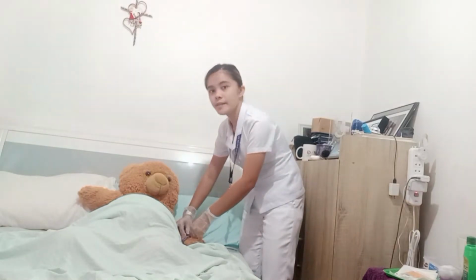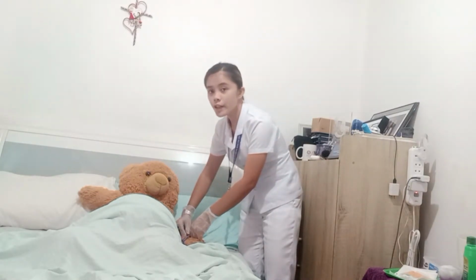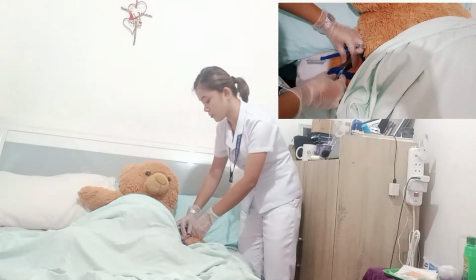So now stabilize the syringe and needle, then inject the amount of solution slowly while watching a small wheal to appear. So if a small wheal appears, all the solution is in the intradermal tissue.